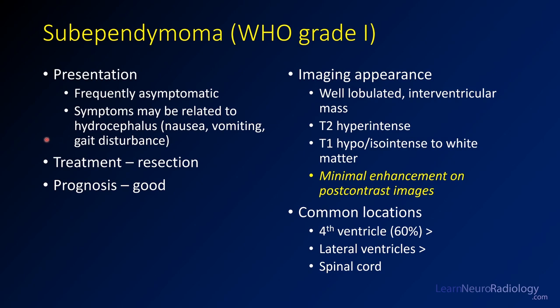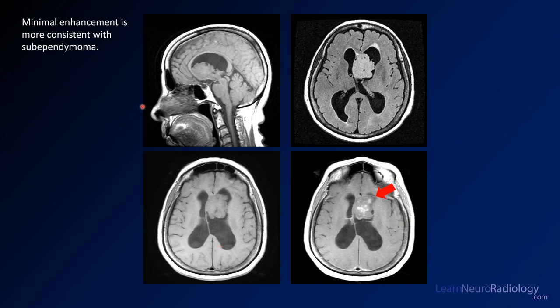Sub-ependymomas are typically somewhat indolent. The symptoms may be related to hydrocephalus — this patient definitely had hydrocephalus. Treatment is resection and the prognosis is good. The key feature in this case is minimal enhancement on the post-contrast images. Looking at the pre and post contrast, you'll see there's very little to minimal enhancement, which makes it much more likely to be a sub-ependymoma than any of those other lesions.